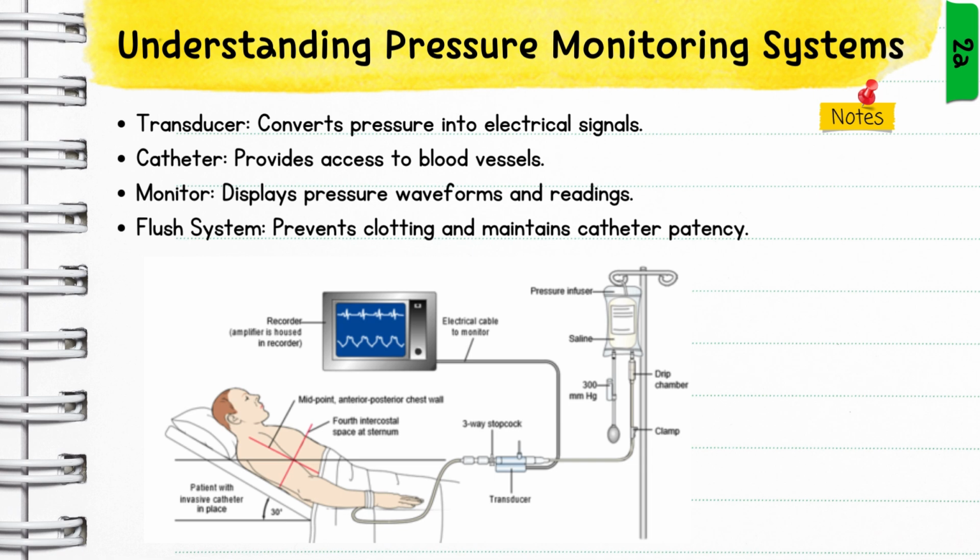If you ever look on the side of those monitors, there's a whole bunch of little port plugs and different things, and they should be labeled. And I will tell you again, the ER, good luck finding the cords. They grow legs and walk away, but the ICU should have them, and they typically zip tie those suckers and don't let them go anywhere because they're really expensive.